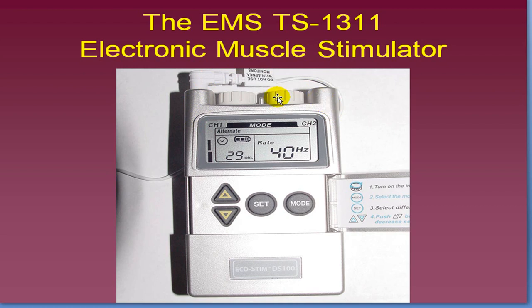So you'd have 2 cables, you'd have 2 channels running out. You'd have a cable running out to electrodes that were on the anterior forearm, and you'd have a cable running here to electrodes that were on the posterior forearm. Of course, the anterior forearm cables would be stimulating finger flexion, and then when that channel shut off, you'd have your posterior forearm electrodes stimulating finger and wrist extension. So that would be an alternating mode.